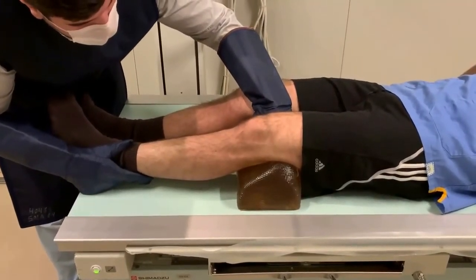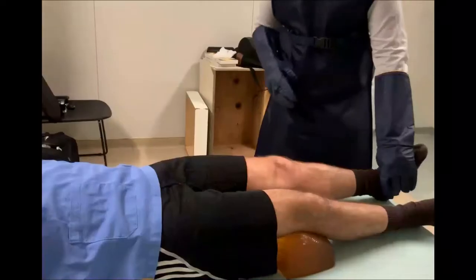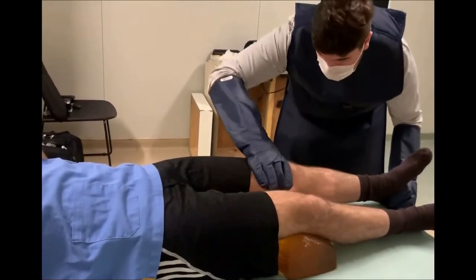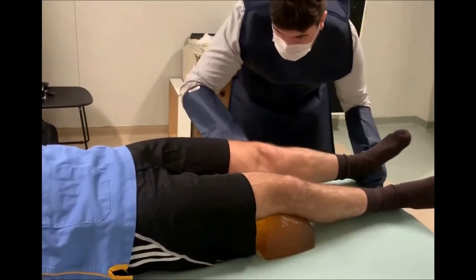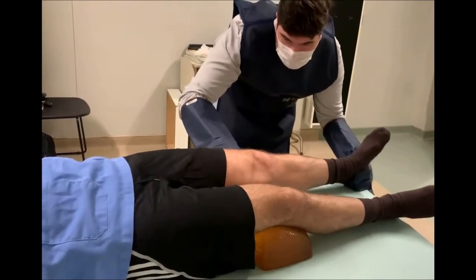We then perform the varus stress X-ray, observing a 1.53 cm lateral opening measured in the digital X-ray software. We then perform the valgus stress X-ray with the knee flexed at 20 degrees, identify the interline, position the hands in the previously mentioned places, and perform maximum stress.